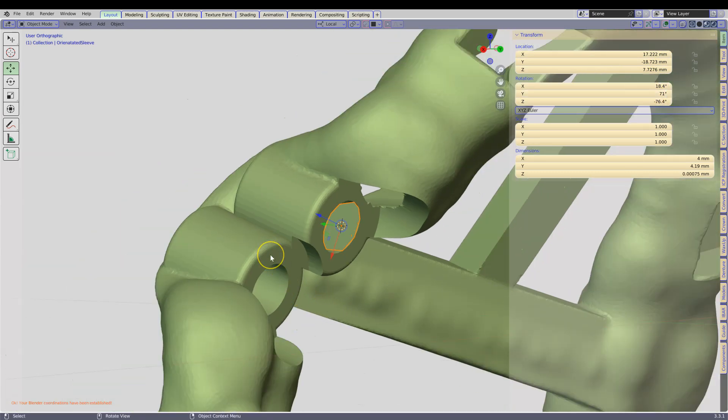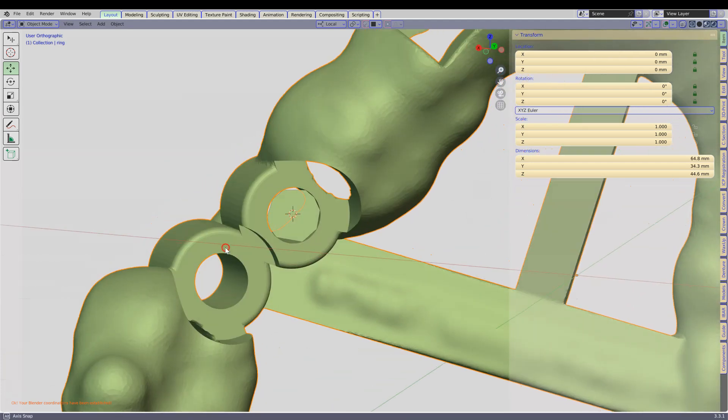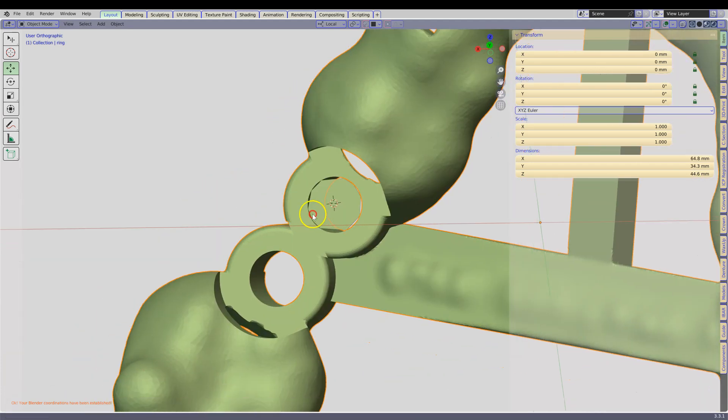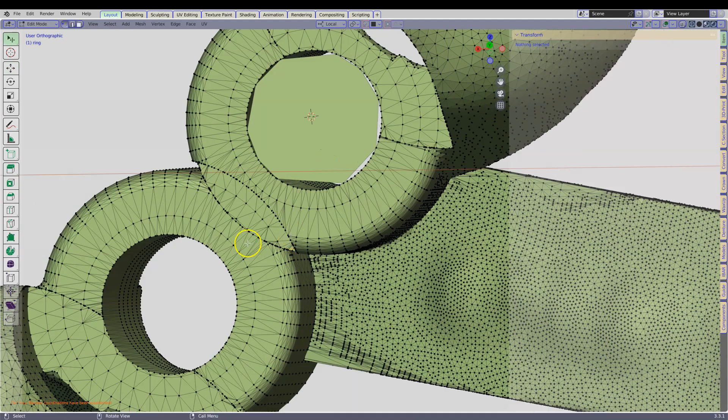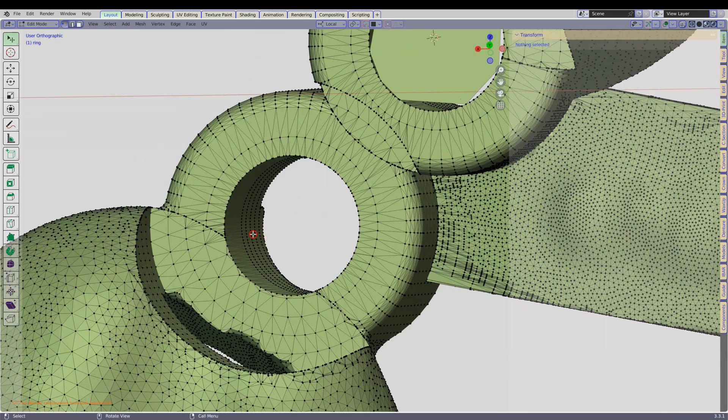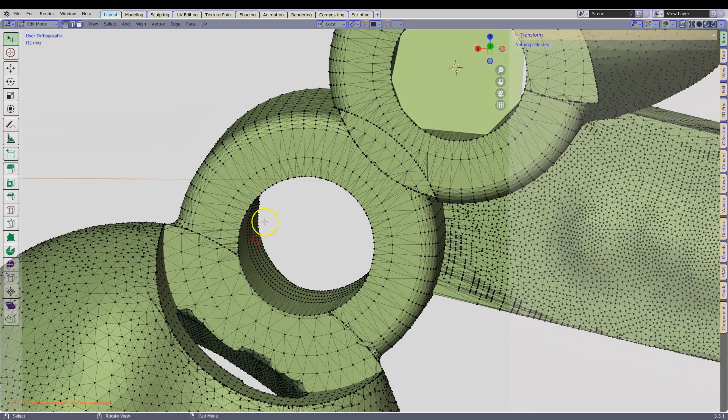We are going to do the exact same for the other side. Tab to enter, Tab to enter, and then select a few vertices.